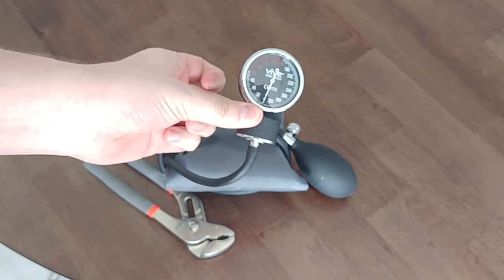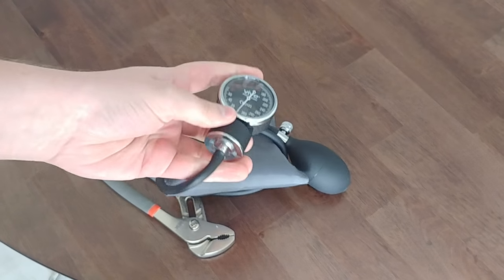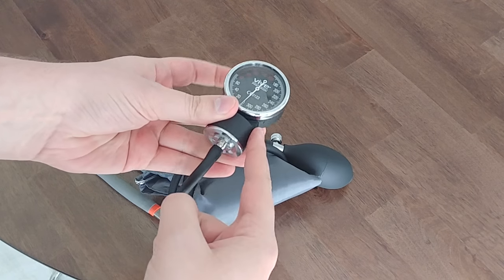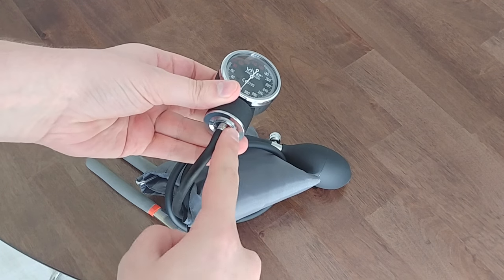Now, all you'll need to worry about is this here. This piece where the hose nozzle attaches to the actual gauge will rotate.